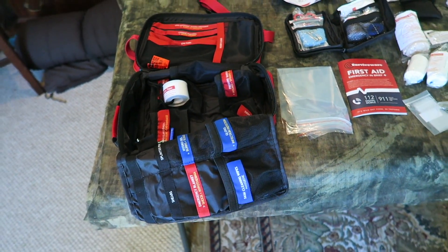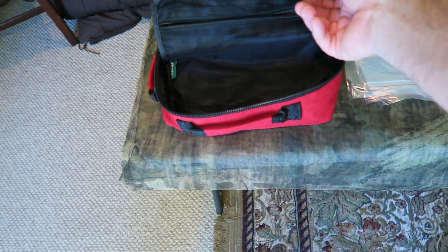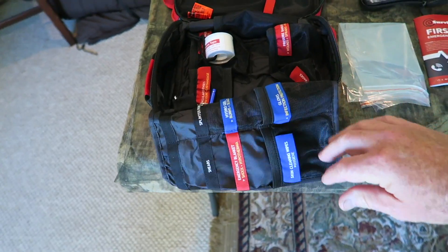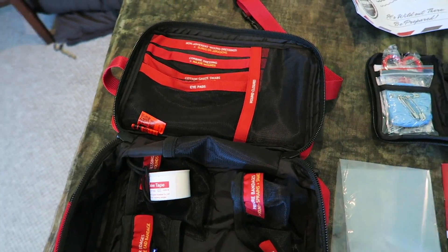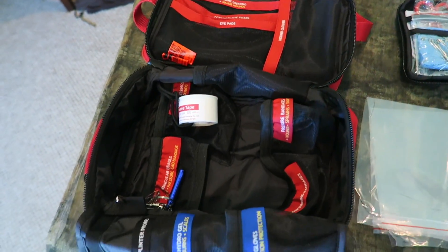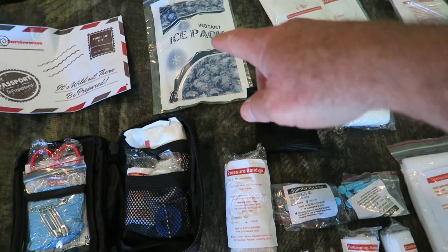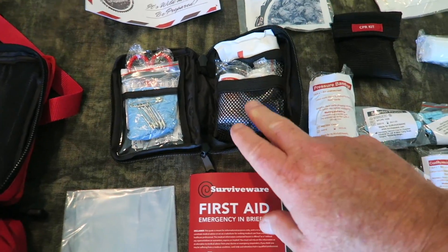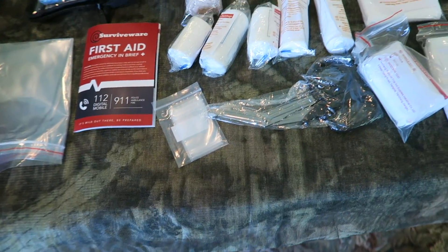There's so much stuff inside that kit, I didn't know if I was going to stop pulling stuff out. There are hidden compartments, zipper bags — there is just an amazing amount of stuff inside this first aid kit. Too much for me to mention. I'll just kind of sweep the camera over it. There's even an ice pack, and they even have a mini first aid kit inside of the big kit. You name it, they've got it.